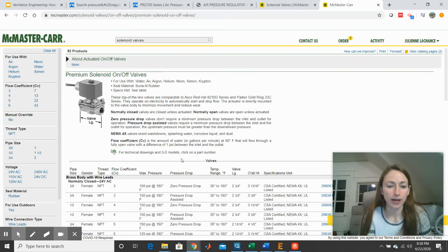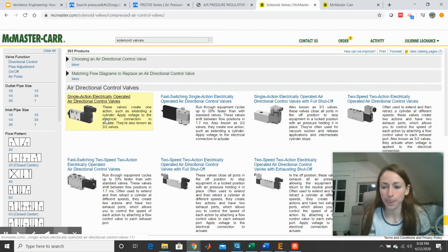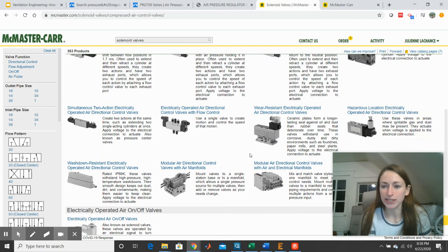Okay. But for my application, I'm looking for a high frequency solenoid. So I'm not going to use one of these on-off valves. I'm going to go to this second category of solenoid valves, the compressed air solenoid valves. Okay, so there are a number of options within this category as well. There are entire manifolds of devices. There are hazardous location control valves.